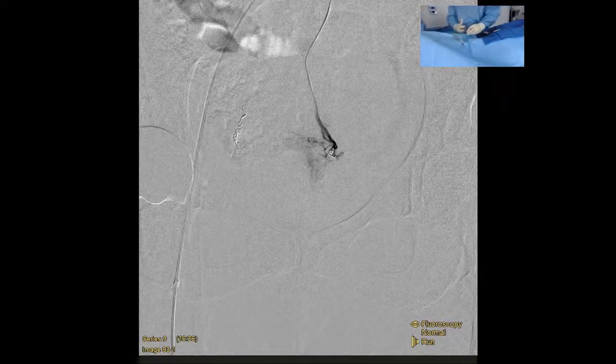I will say fibers on coils. Why don't you give me your thoughts on coils with and coils without? I prefer fibers. Coils are not, for the most part, mechanically occluding. They're creating thrombus that's going to occlude. Although there are some technologies out there that are trying other things, my greatest experience is with fiber coils, and that's my bread and butter.